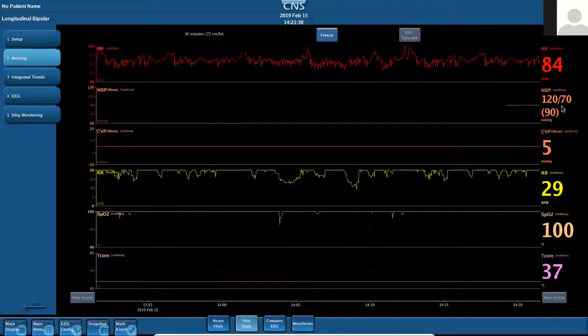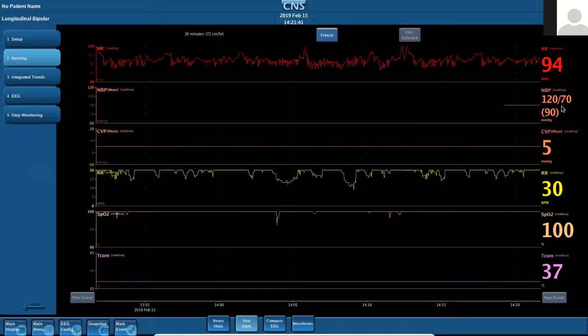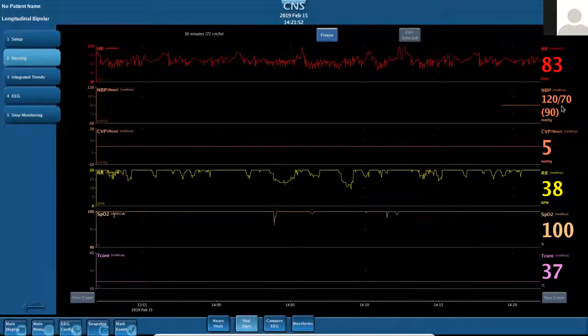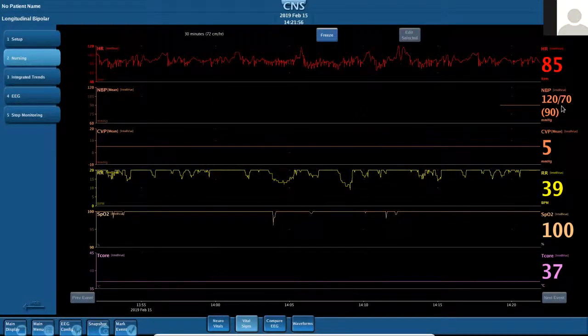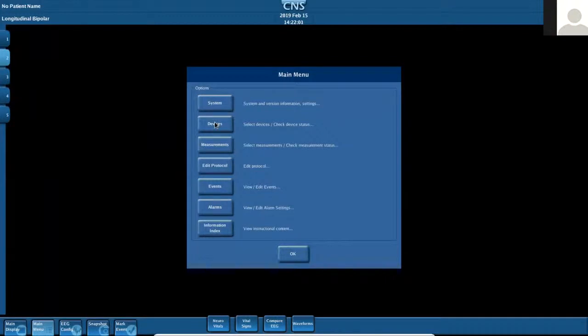Tracy, I just have a quick question. So in some units that are going through retrofits and things, they might have some devices in one room. I'm thinking the physiologic monitors. They might have some older generation or a totally different brand in one area, and then they have a different brand in another. What would be the best practice for those units? Would they want to make sure they enable all of their legacy devices in there just in case, or would you make two different protocols?